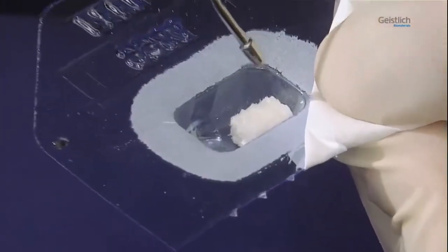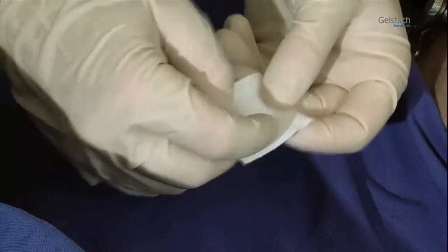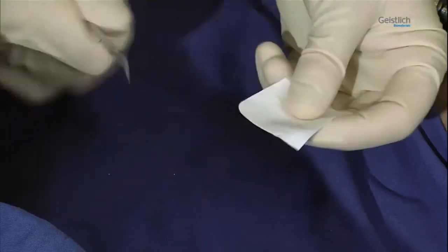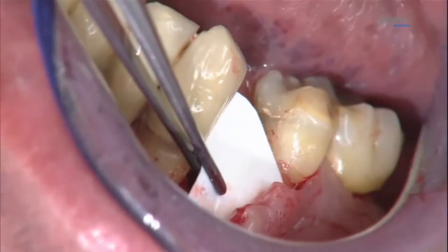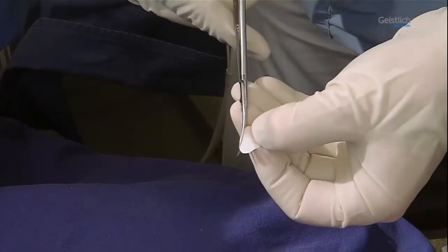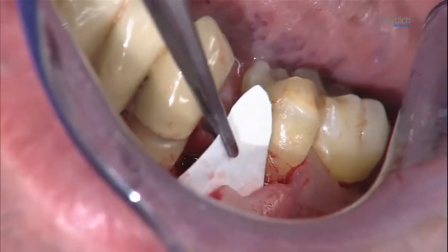The Geistlich Bio-Oss Collagen block absorbs liquids well. Once we have removed the membrane from its packaging, the paper of the blister pack can be used as a template to determine the proper size and shape for the membrane before working on the actual membrane. To this end, we cut the template to size and hold it against the defect to check its fit. In this case, the template is further adapted to attain a pear-shaped form, ensuring that the membrane will completely cover the implant and the bone defect.